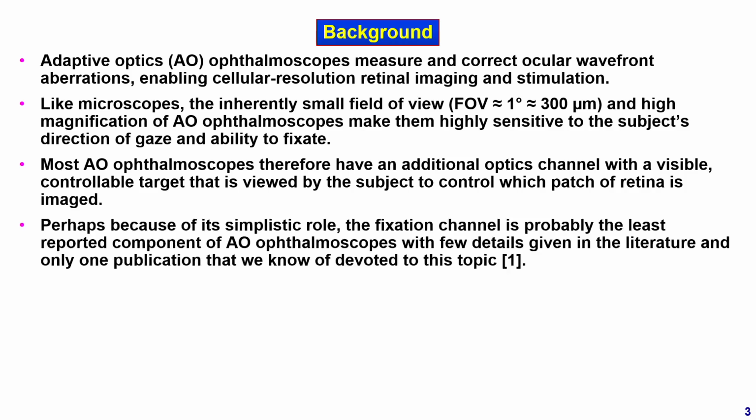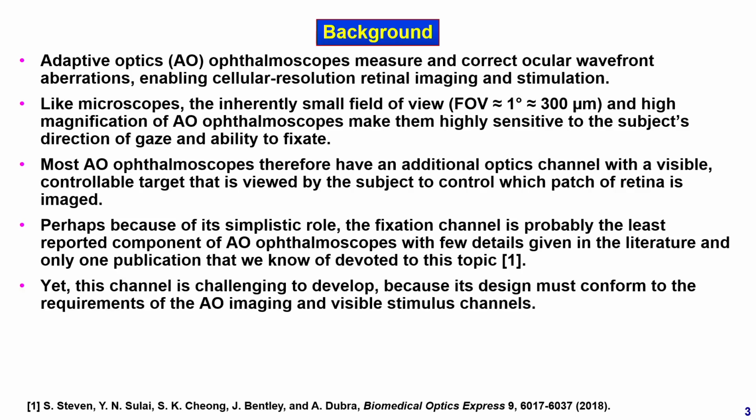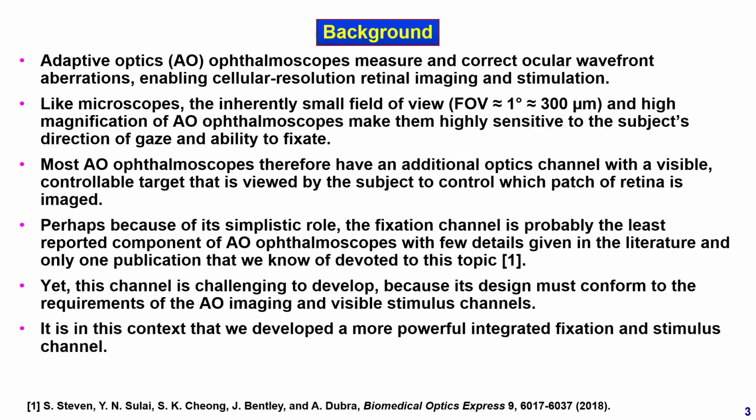Perhaps because of its simplistic role, the fixation channel is probably the least reported component of AO ophthalmoscopes, with few details given in the literature and only one publication that we know of devoted to this topic. Yet, this channel is challenging to develop because its design must conform to the requirements of AO imaging and visible stimulus channels. It is in this context that we develop a more powerful integrated fixation and stimulus channel.